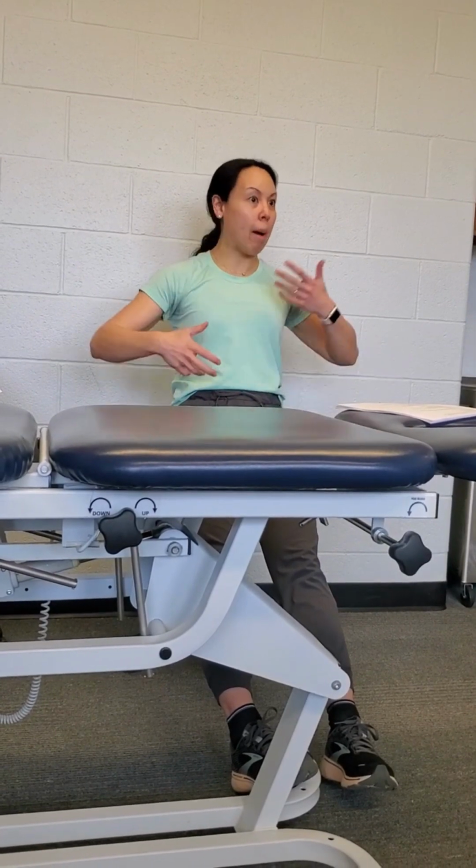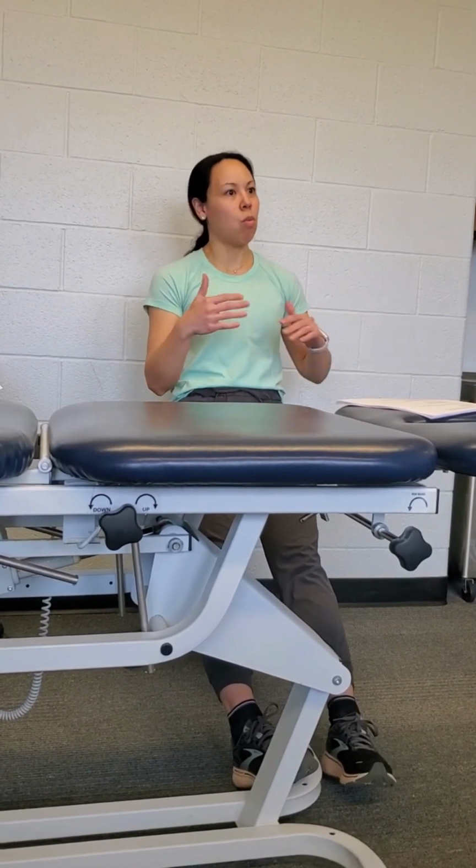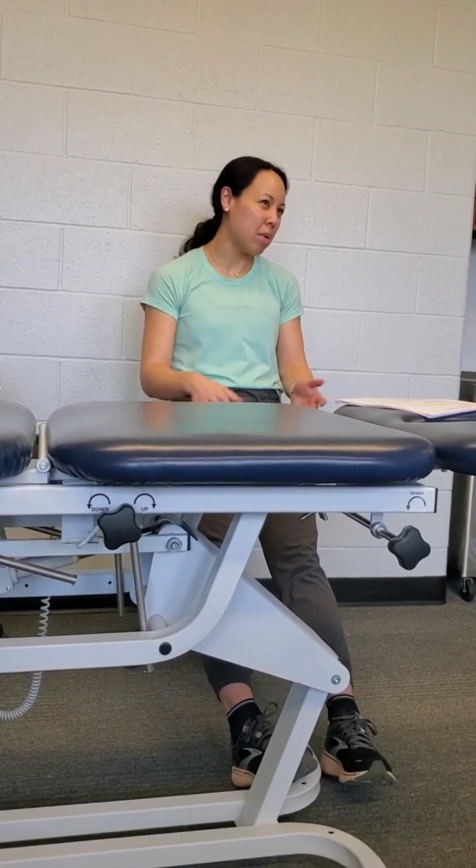So you could have the patient do something else, say they're doing the arm ergometer and you're charging for that, but then you might have to put them on the BFR, like have them come in 10 minutes early or something, where you can watch them while you're with your next patient. Do you know what I mean? Because if you're just doing it passively, you can get away with it, but you can't really charge for that right now. So does that make sense?